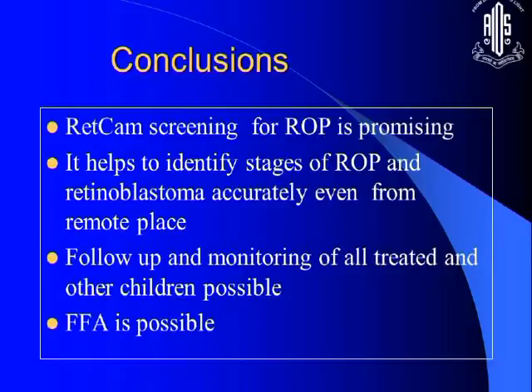The retinoblastoma, as I said, we have picked up retinoblastoma. I didn't even see that. They took an image and there was a retinoblastoma. We were screening for ROP. And follow-up and monitoring of all treated children of various diseases is possible here. And you can do a very good angiogram, as I have already demonstrated, if you have RetCam 3, which at present we are trying to acquire for our center also.